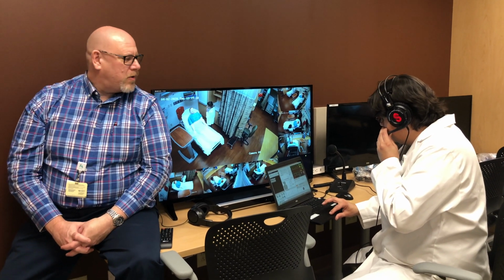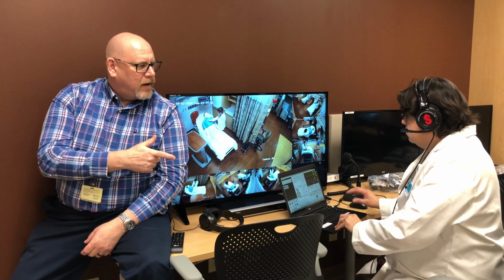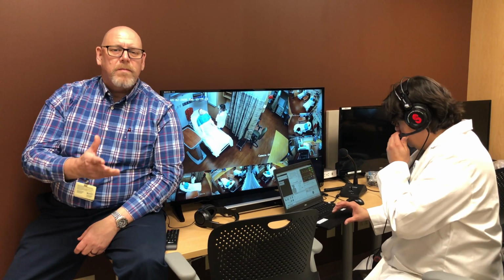Here we are in the control room. This is where the instructors go to observe what happens in the patient care area. As you can see, our instructor has on a gaming headset, and everything the instructor says comes through the mannequin.